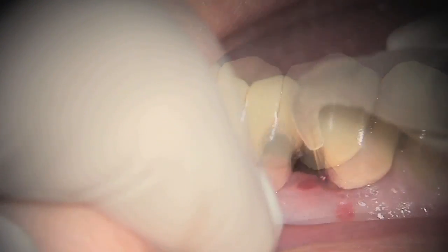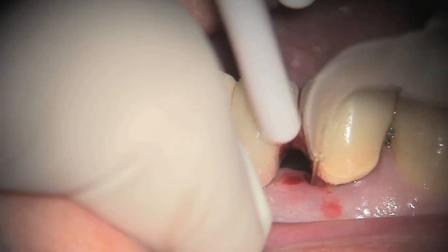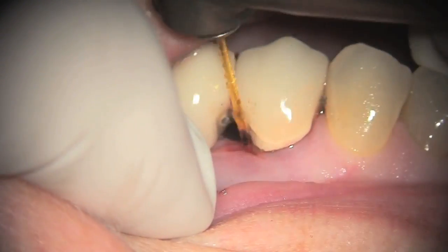The first step is to remove the diseased epithelial lining to 1mm shy of the bottom of the pocket. During this procedure, we are also biostimulating the tissues, which is very, very important for tissue regeneration.